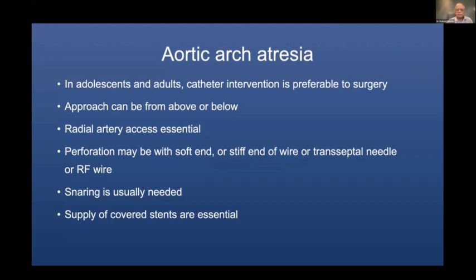Perforation can be from the soft end or the stiff end of the wire, or a transseptal needle or radiofrequency wire. Snaring is usually needed, whether it's above or below, and you need a really good supply of covered stents to manage these patients. I'll stop there.